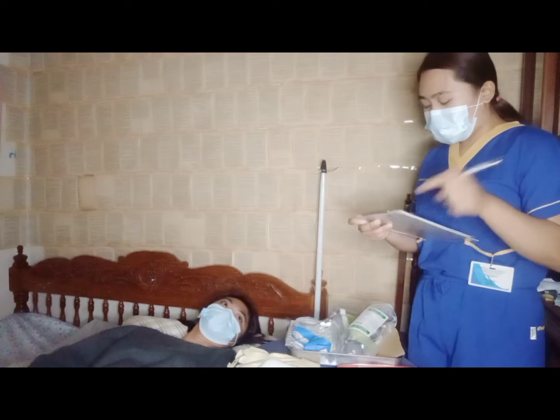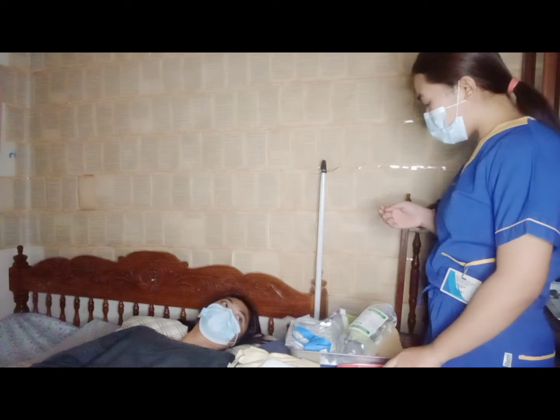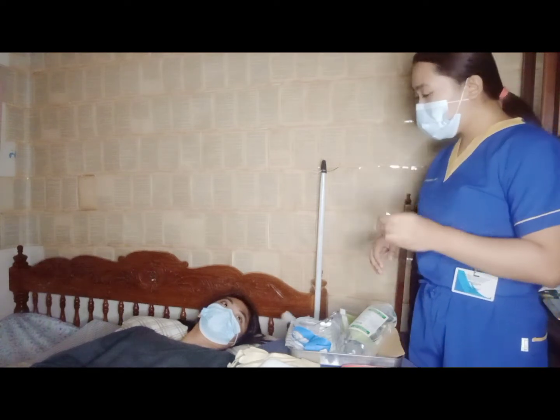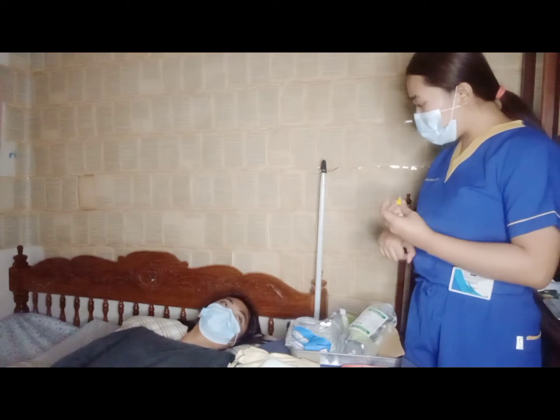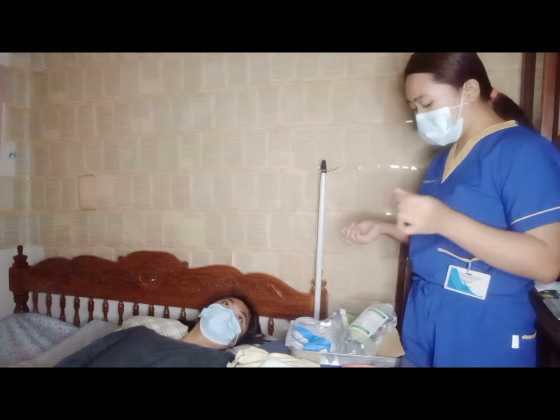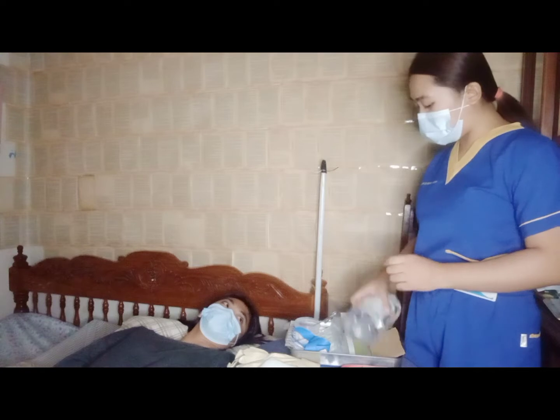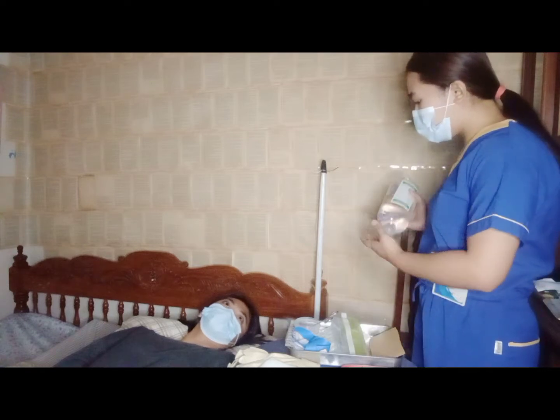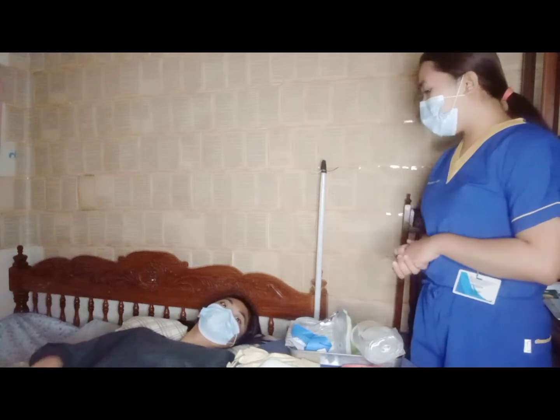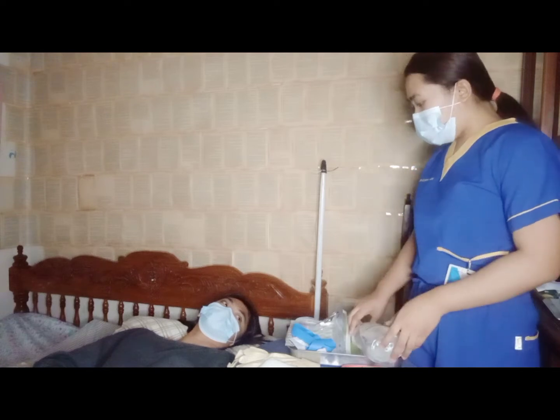Okay, ma'am. Para sa procedure natin, i-explain ko po sa inyo, mag-insert po ako ng needle, this one, which is called the cannula. I-insert ko to sa inyong vein at i-attach ko po yung tubing dito sa ating catheter. Yung tubing po na yun is naka-attach din po dito sa ating solution at dun po mag-flow yung solution. And yung other medication nyo po is idadaan po natin through dito sa IV solution natin.